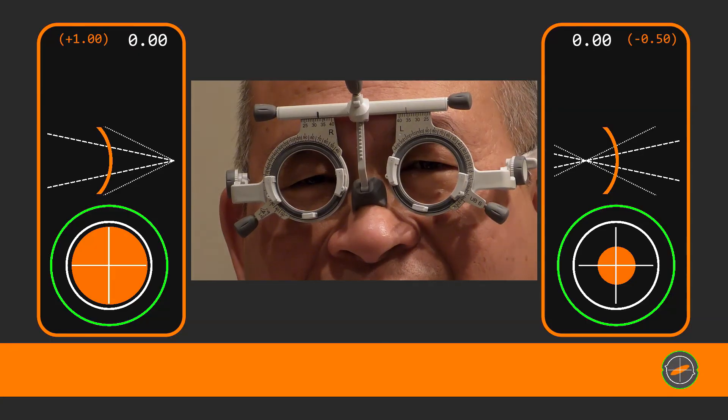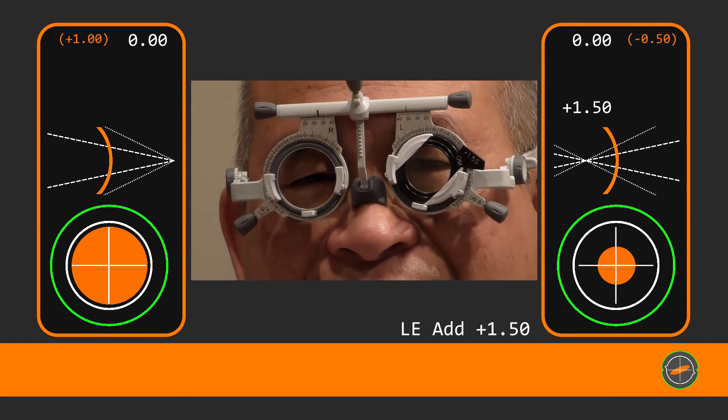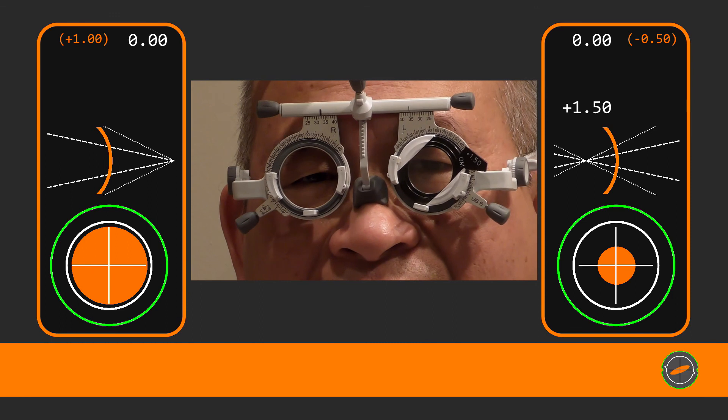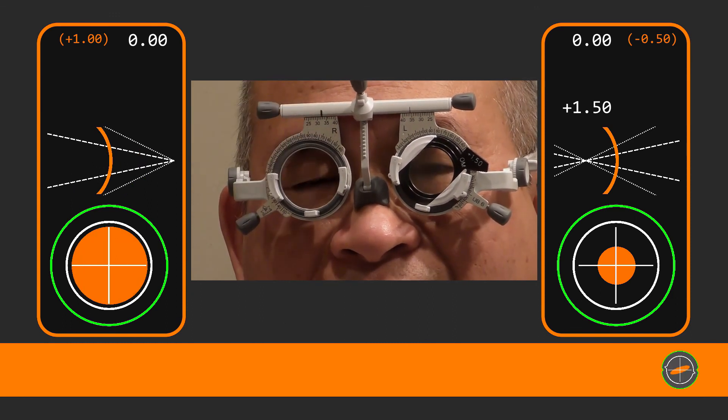Let's just run it through again so you can see the whole thing through. I've speeded it up a bit so we'll go through the clinical tips again afterwards. Right. I'm just going to put this in here. There we go. Is that a bit blurry? And just have a look at that line there, 612 line. And if you look at that line there, is it better with this one or better without? With. Better with.